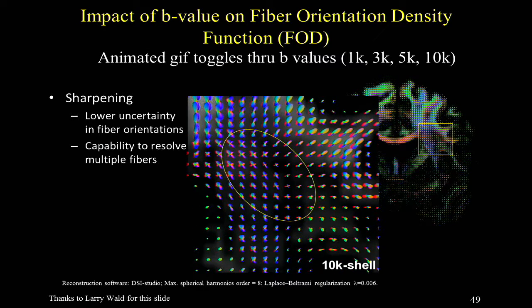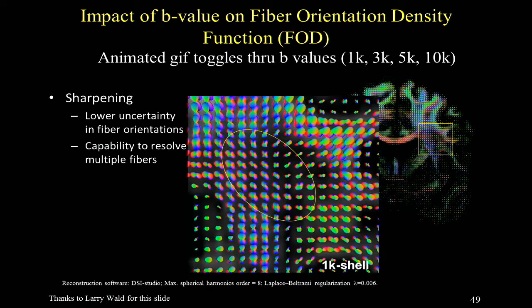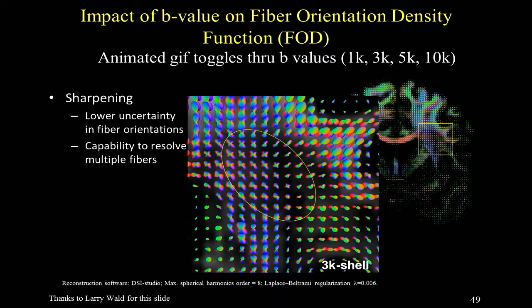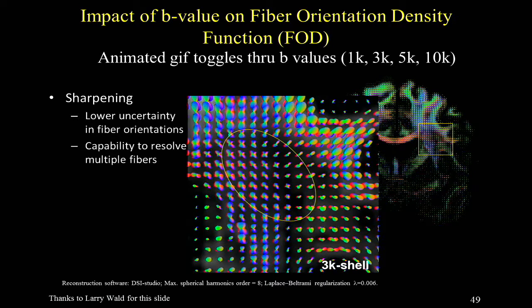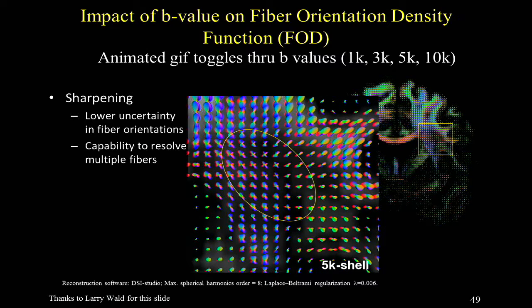And what the GIF is showing you are these orientation maps. So in diffusion imaging, we don't acquire scalar images. We acquire orientations at each point. And we can acquire multiple orientations in order to try and get an idea of where axons are going in space. Okay, kind of a simple idea. And the game of diffusion tractography is to take these different orientation maps and draw lines through them, right? And to kind of stitch them together so that I get models of major fiber tracts in the brain.